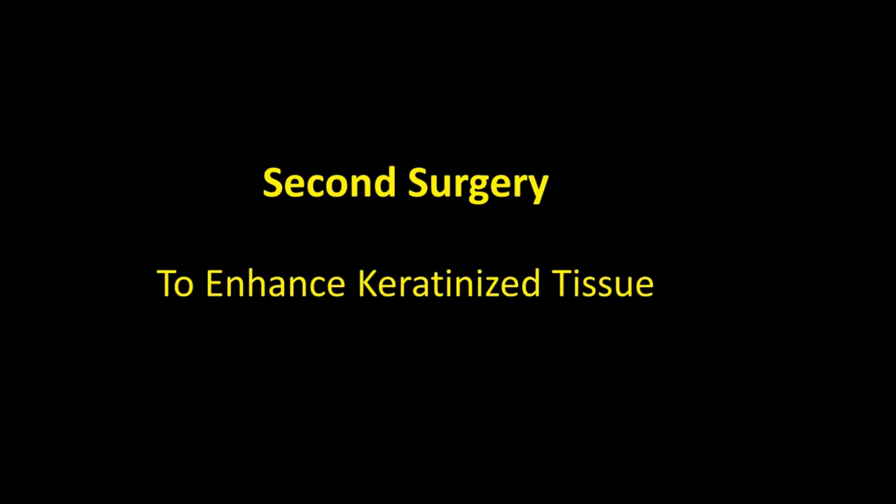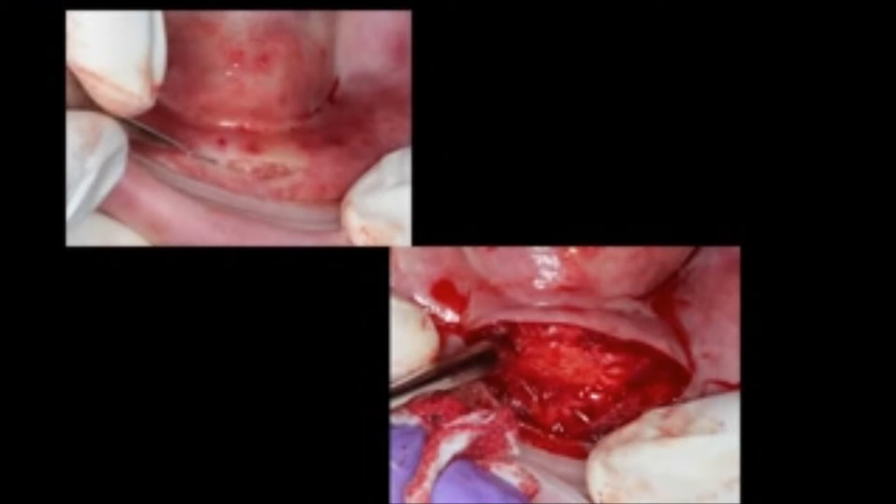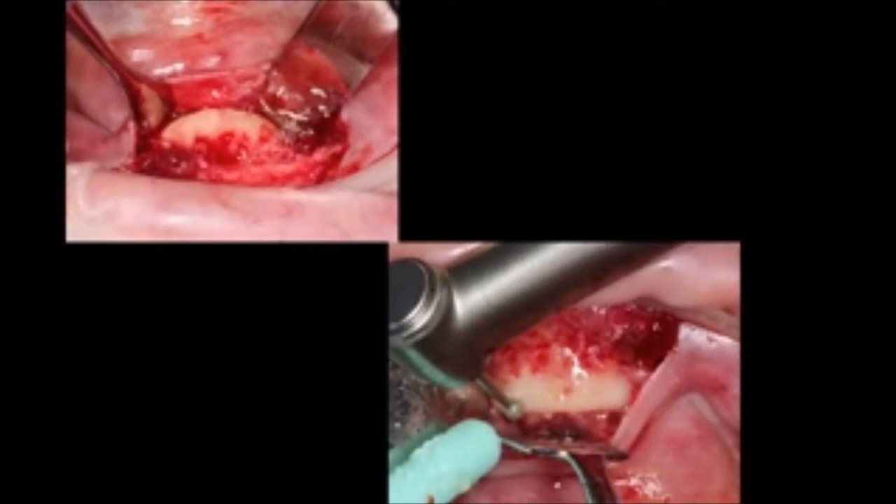Here is contact information should you want to order the Dental Surge unit or any other Ellman products. We're now ready to perform the second surgery — a graft in the mandibular anterior area to enhance the keratinized tissue. Here we see the golf ball area she talked about. We'll use an envelope flap, expose the area, do some osteoplasty to flatten this area and create a broader base to place the implant. Perhaps two implants could be placed here, which would be more ideal. However, financially, she chose to go with just a single implant rather than two.